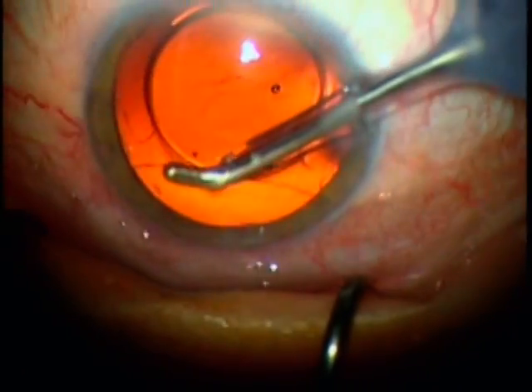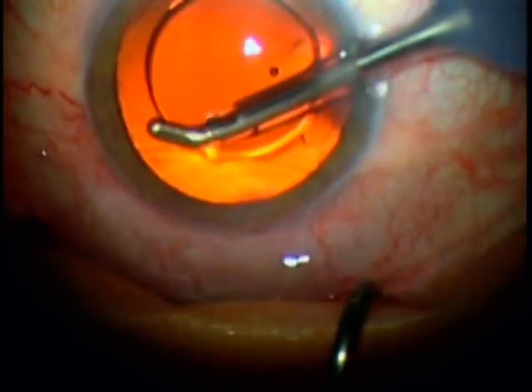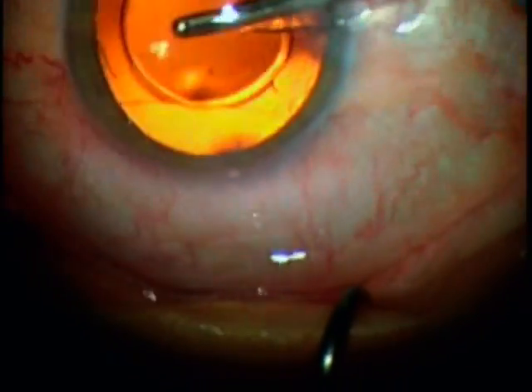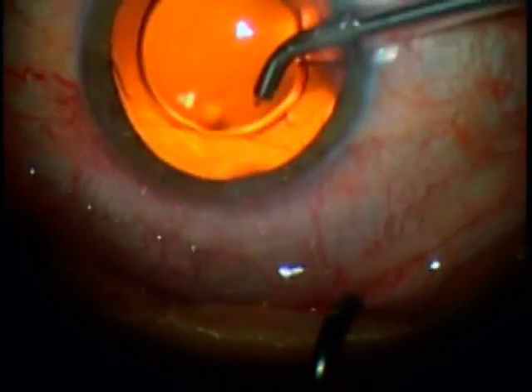Viscoelastic removal is then performed, and the lens is extremely stable during this procedure, with very little lens jump even when removing viscoelastic from behind the lens, and there's certainly no lens rotation.